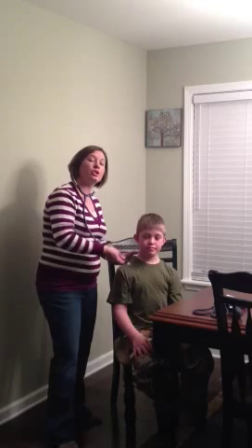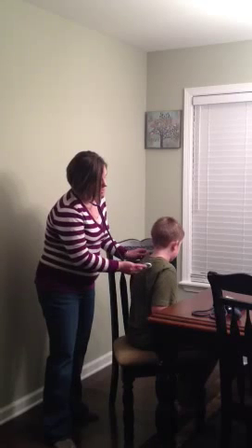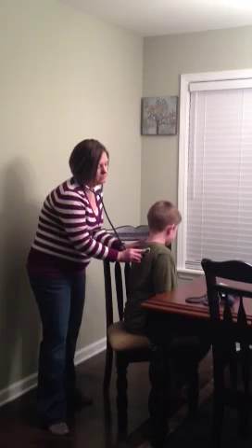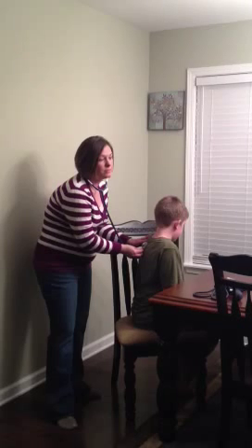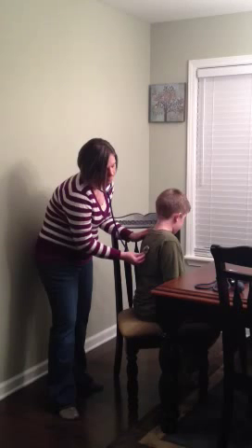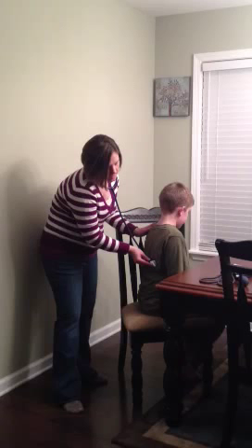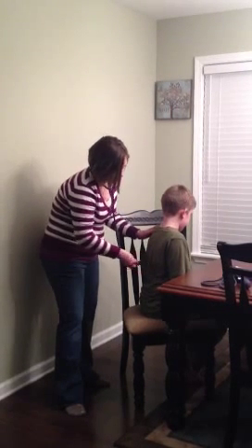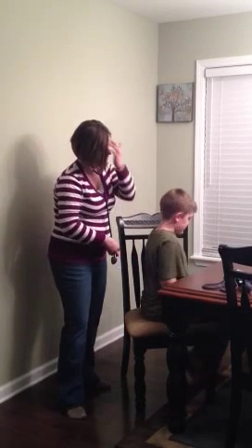Okay, now I'm going to ask him to turn around so we can listen to the back as well. So we start up here at the top again, ask him to take a big deep breath. Another one. I'm going to go down here about the shoulder blades. Listen across from it. Then we're going to listen to the side a little bit. Listen to the other side. Okay, you can turn around, Caleb.